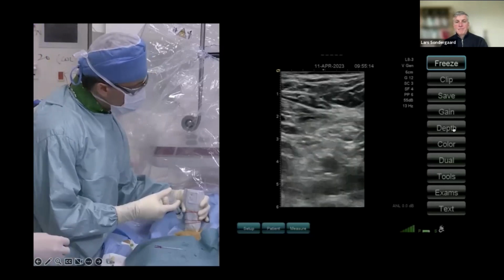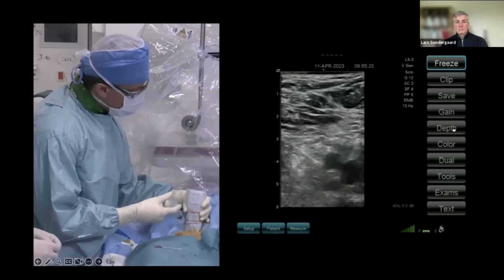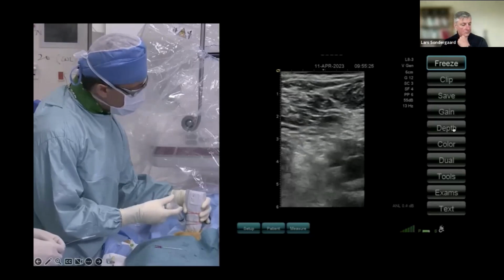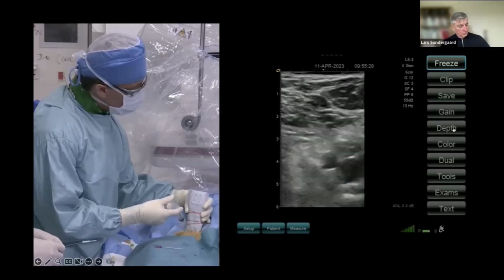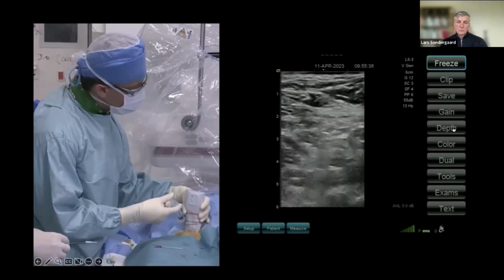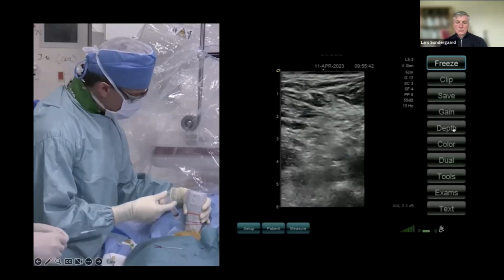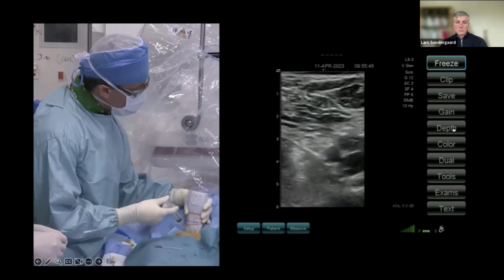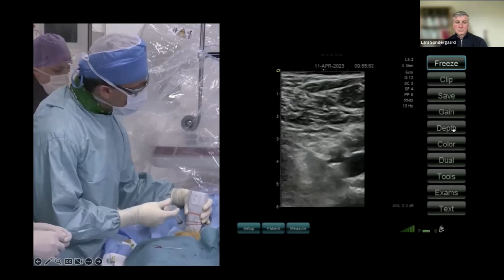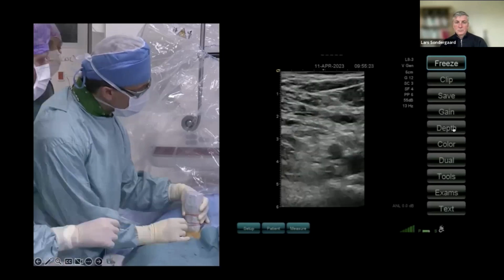So first it's important to identify the location on the artery where you want the needle to hit the anterior wall of the artery. And typically, the more obesity you have, the more distal to that artery the skin puncture should be, because of course it takes space for the needle to traverse the subcutaneous tissue. And then it's a little bit of guessing how far you should start your puncture. Again, the more obesity there is, the more distal. I'm just a couple of centimeters distal.